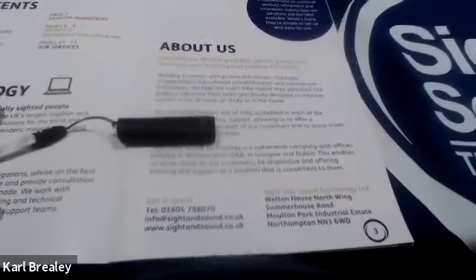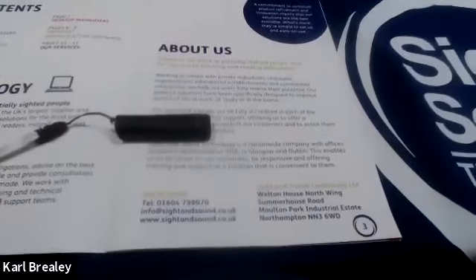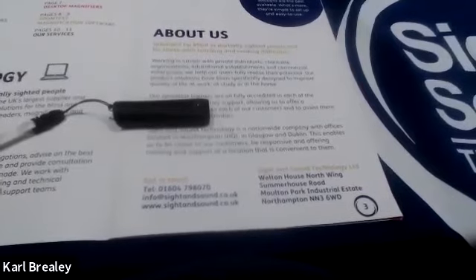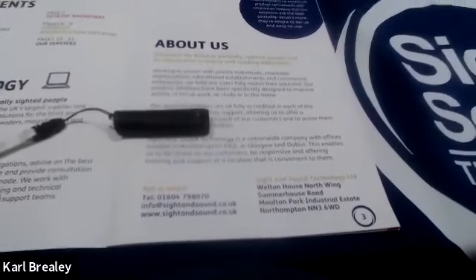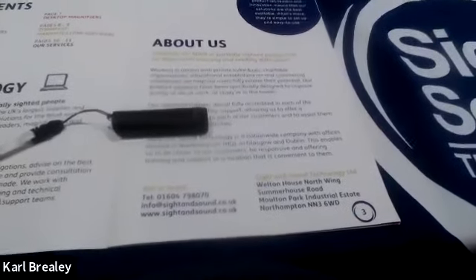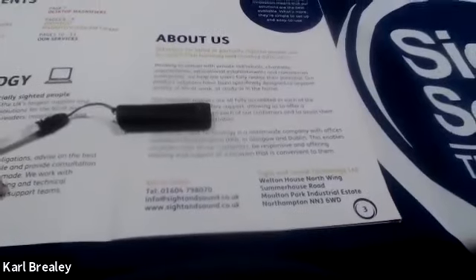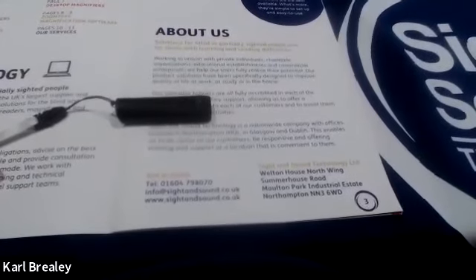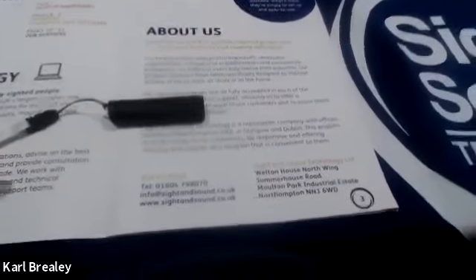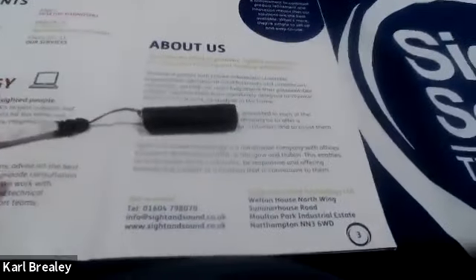I had one customer that wears the wraparounds. We couldn't get one of the bands big enough to fit it. So with his permission, I cut all the ties off and super glued the attachment onto the side of his glasses. So there's a way around everything. But yeah, they will go on any glasses pretty much.